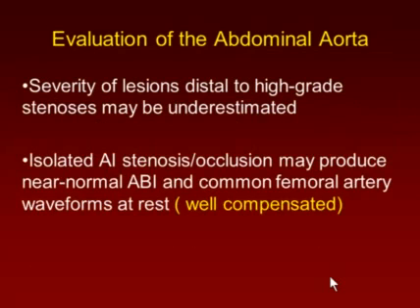The severity of lesions distal to a high-grade stenosis may be underestimated, so that may be a limitation of the exam as you go through. If you have a high-grade stenosis and then encounter further stenoses downstream, those stenoses may be underestimated in their severity because the head of pressure isn't going to be enough.